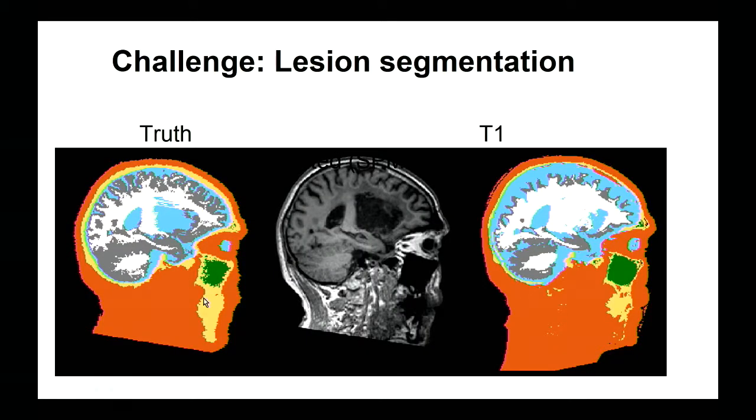So there are a lot of tools already available for doing automatic segmentation of images. But we have the experience that in clinical context with biomedical images, segmentation is still a bit of a problem, and we have some difficulties with it. Especially, current state-of-the-art segmentation tools work with atlases that are made from healthy subjects, and they are used to assign prior probabilities on tissue location and aspect.